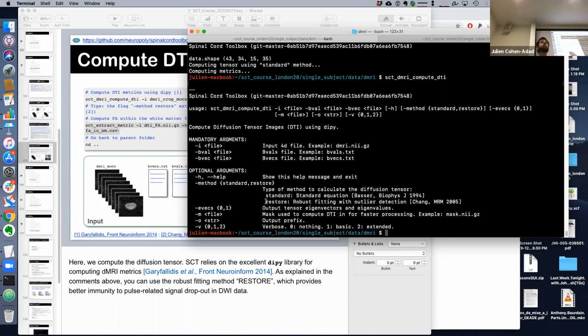So it's great to do QC. I strongly encourage everyone to do QC, but instead of manually discarding problematic slices, other fitting algorithms could also be used, potentially giving less variability in the metrics. Yes, you should take out the large signal drop data. But it's true that if half of the image has a hole, then it will take out a lot.